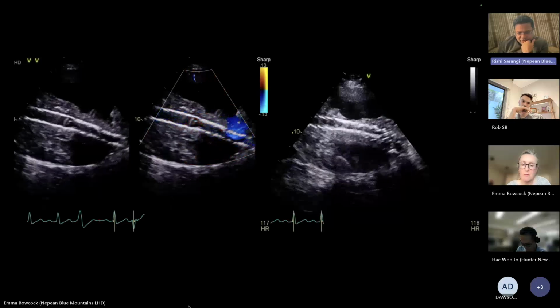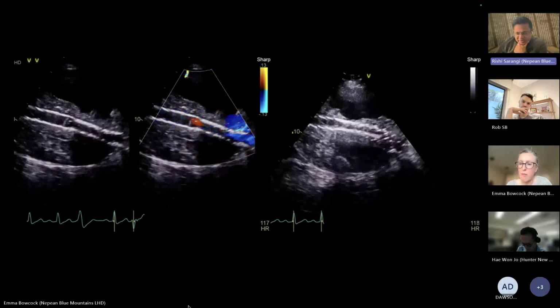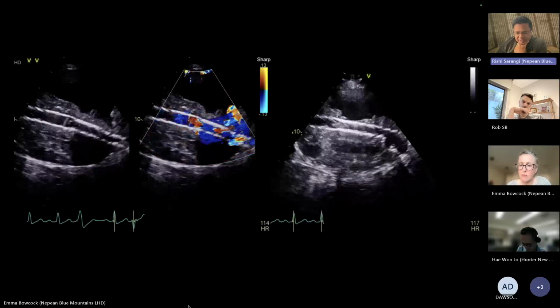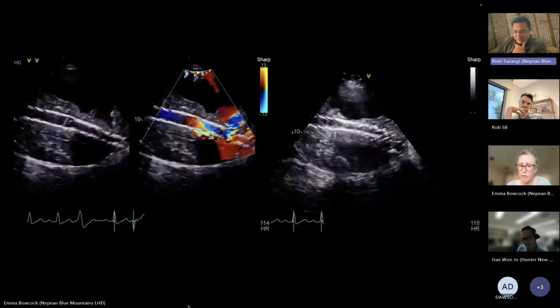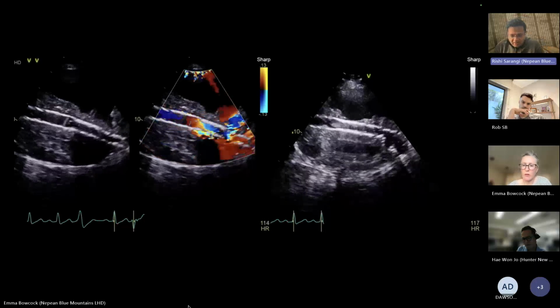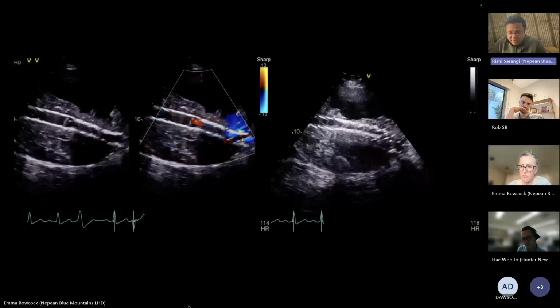It's hard to say on the 2D picture, but there appears to be some homogeneous material inside the graft, so that is highly concerning. Given this patient is hypovolemic and septic, is there any clot forming inside the graft? That would be my concern, which could also explain the flow acceleration and the turbulence I'm seeing.